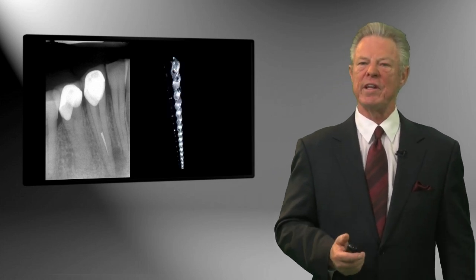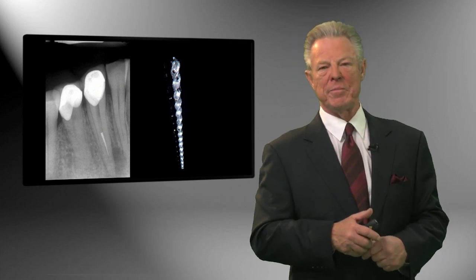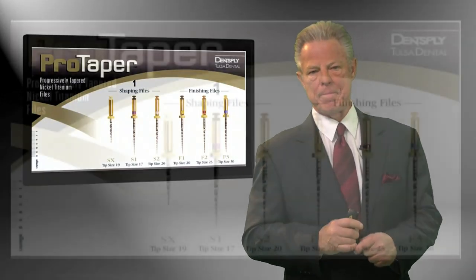Still, in 1995, we were concerned that these things could break. You know, endodontists and others can remove these things many times, but it's something we want to avoid, and we can. So in 2001, we launched ProTaper.